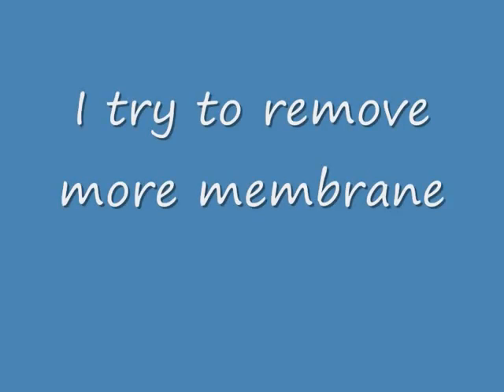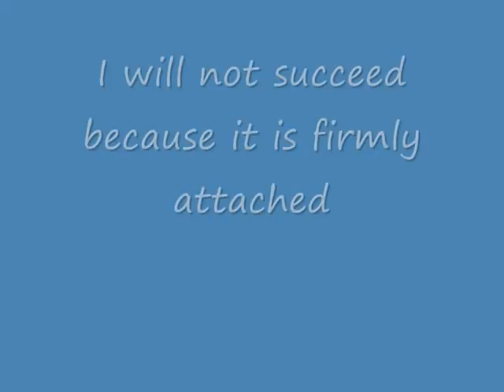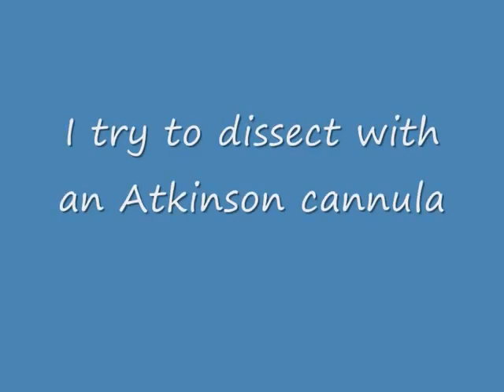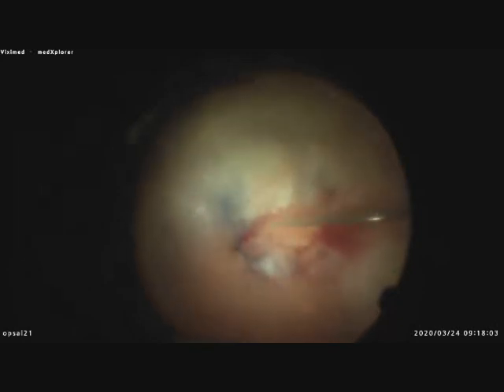This is all I can remove in terms of membranes in this eye. I will try to remove more membrane — I am working now at the posterior pole — but all these membranes are very, very firmly attached to the retina. I also try to dissect with an Atkinson cannula, but no chance. The same at the inferior pole: this white tissue is very firmly attached to the retina.